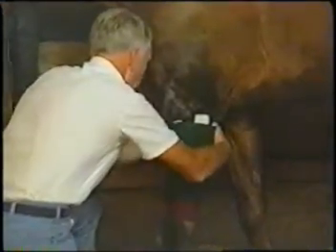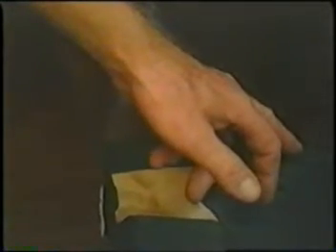You can see how it's contracting rhythmically, at least I think twice per second. And although you can't see that too well, every about 30 seconds it switches from the front to back, so that each group of muscles is given a rest. Now you see the muscles, it has stopped, and the stimulation has switched to the back. You can't see that too well, but now the front has started to move again. So the muscles never fatigue. There is no such thing as the horse getting tired in any way whatever.